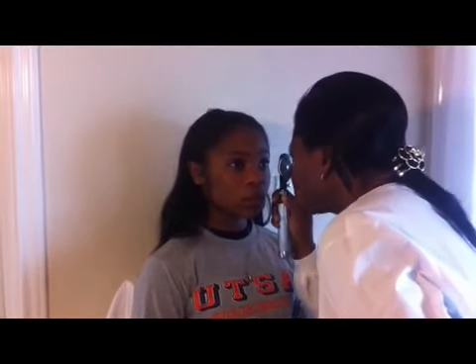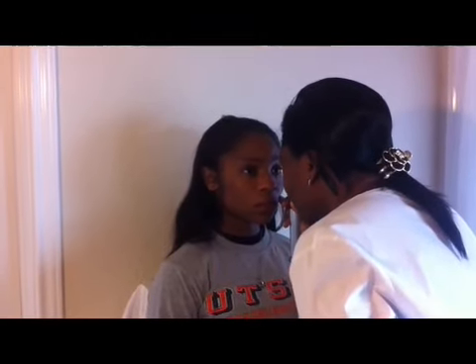I'm just going to check this eye one more time. Okay, I just did the fundoscopic exam. The optic disc, there's no inflammation. The optic disc is creamy yellow. It's round and its margin is pretty much distinct and sharply demarcated.